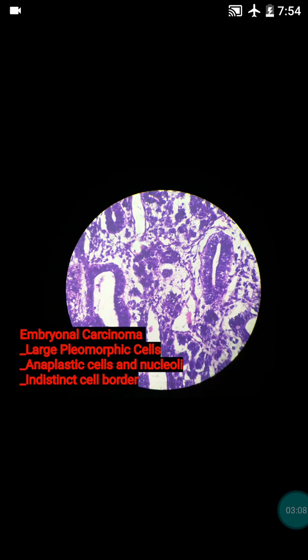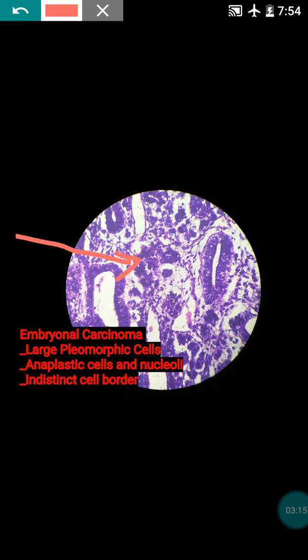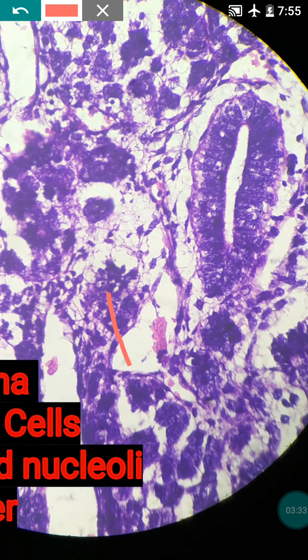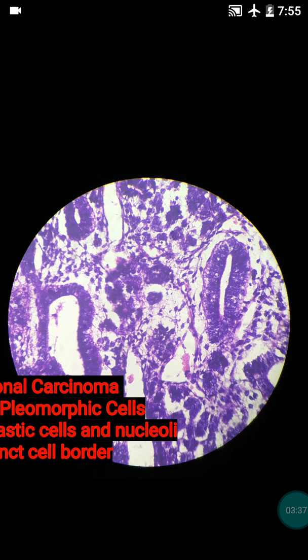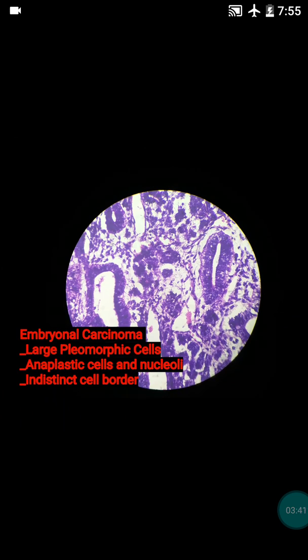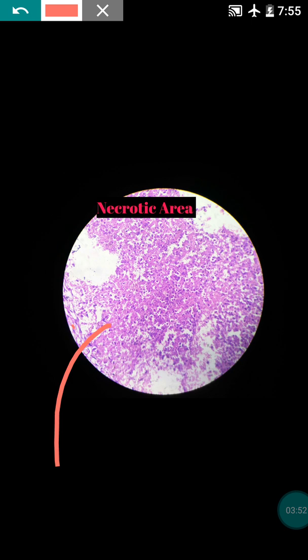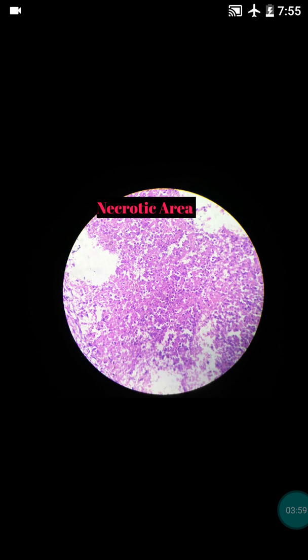We also observed large pleomorphic cells — very anaplastic with a high degree of pleomorphism and indistinct cell borders. In high power we also noted prominent nucleoli in some cells. All these features are suggestive of embryonal carcinoma of the testes. We also found necrotic areas with inflammation, which are particularly seen in embryonal carcinoma.